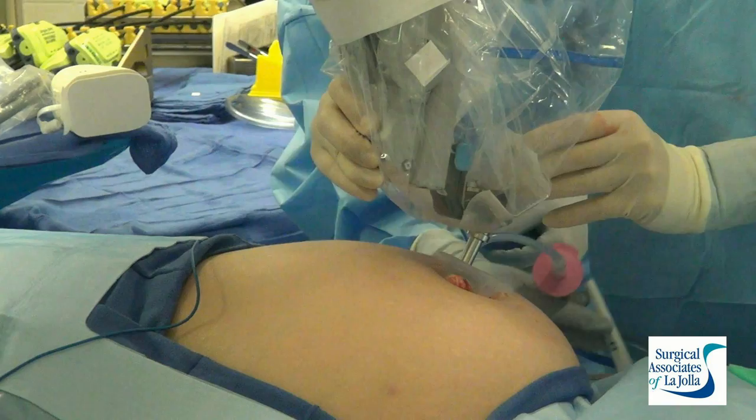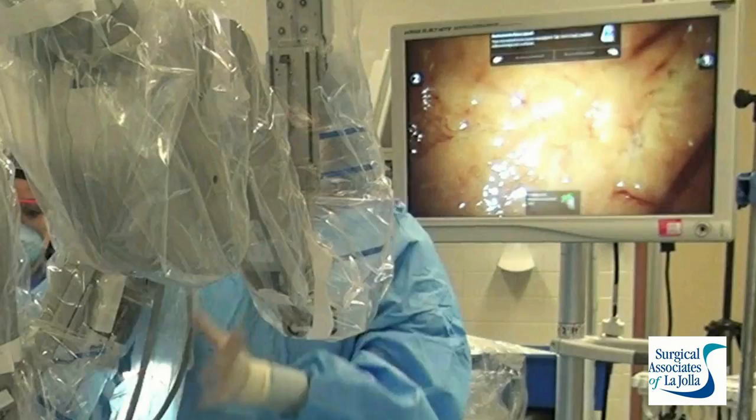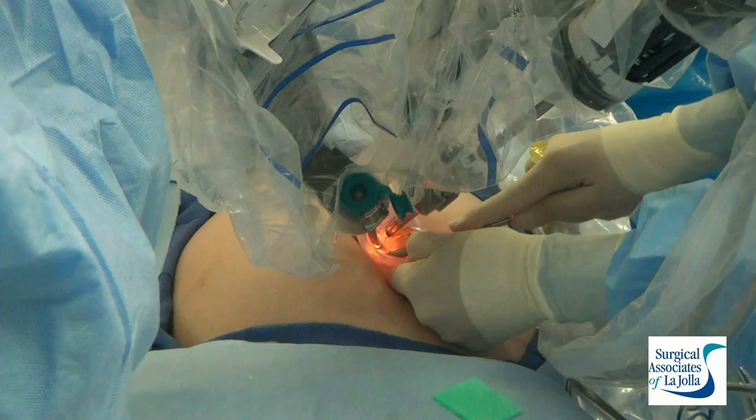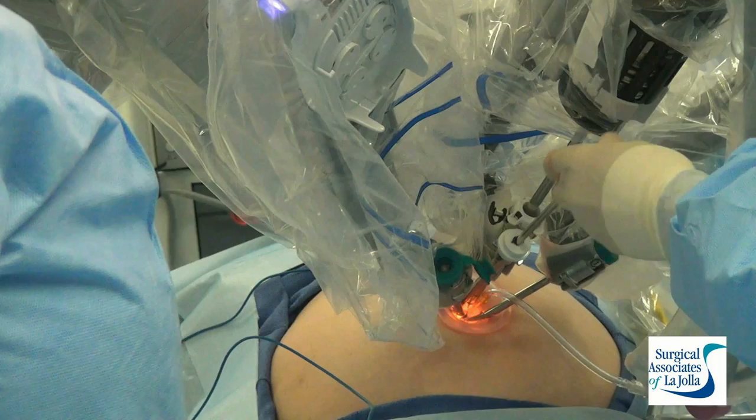We dock the camera port first, connecting it to the arm so that the robot senses that it's connected, getting that in place. Then under direct vision we insert the curved cannulae. We're positioning the camera so that I can see as I insert that curved cannula and always know where it is.